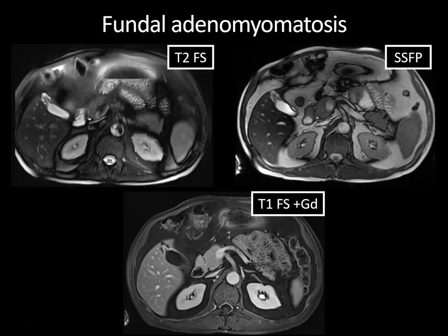The patient also had an MRI, which does have increased sensitivity in this diagnosis, and you see essentially the same findings — these multiple little cystic areas causing a string-of-pearls appearance on these fluid-sensitive sequences. Notice again how you see the gallbladder lumen invaginate into this fundal adenomyomatosis. We do have some mucosal thickening and enhancement here, but not mass-like thickening. So this is a benign diagnosis — it does not require surgery.